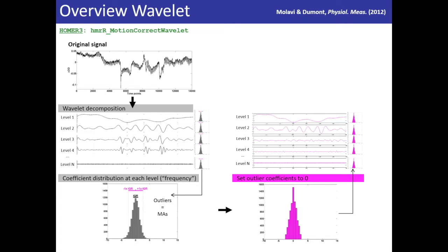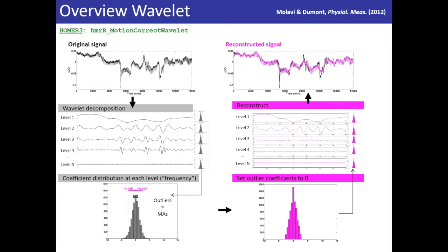Sorry, going back. And then what we do is we recompose the signal back by an inverse wavelet transformation, and it nicely corrects for spikes, but not the offsets in the signal. You see, this spike is corrected, but there's this baseline shift.